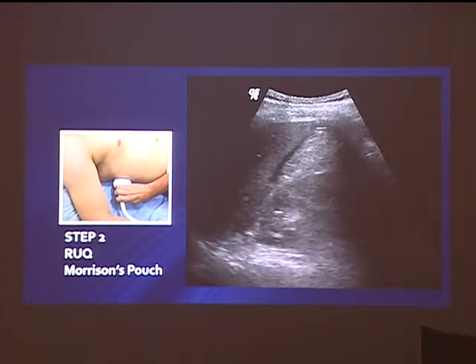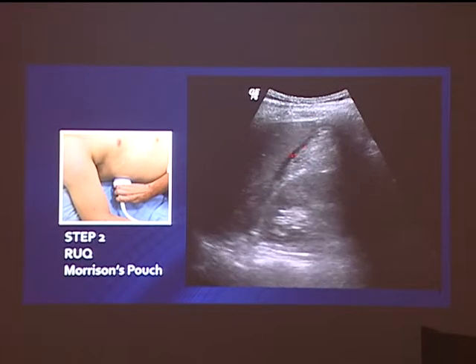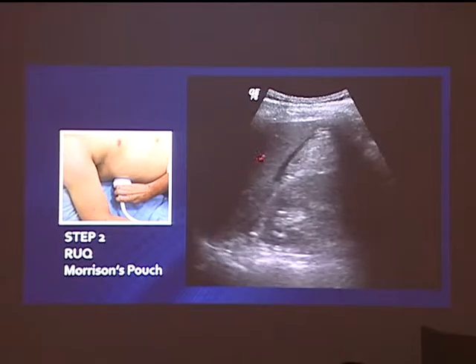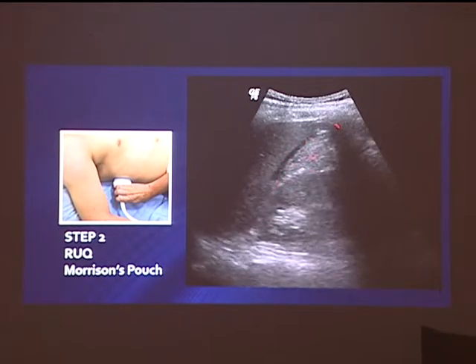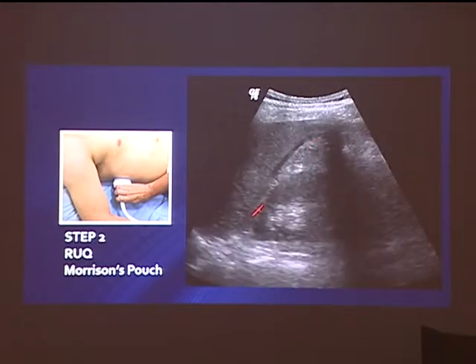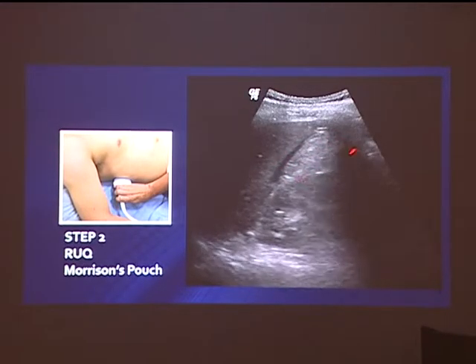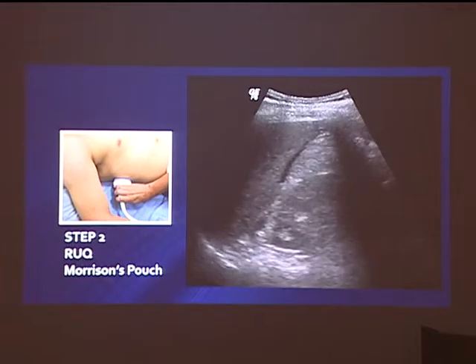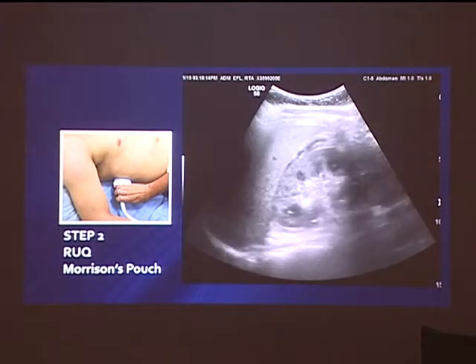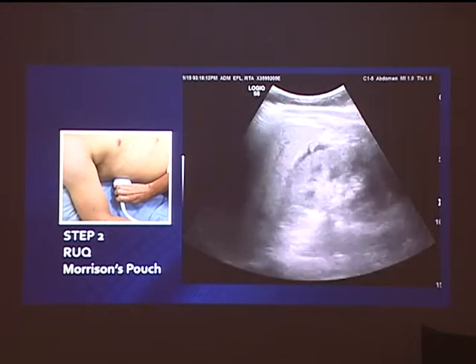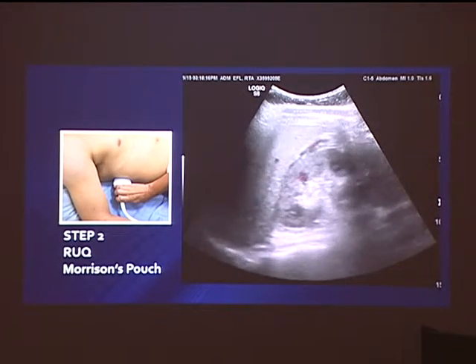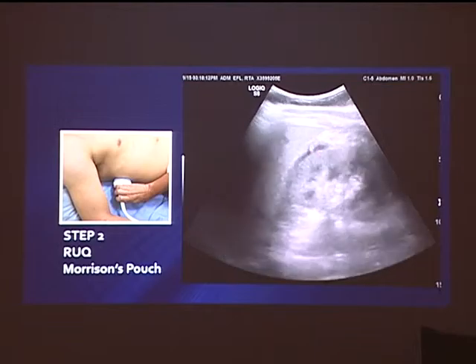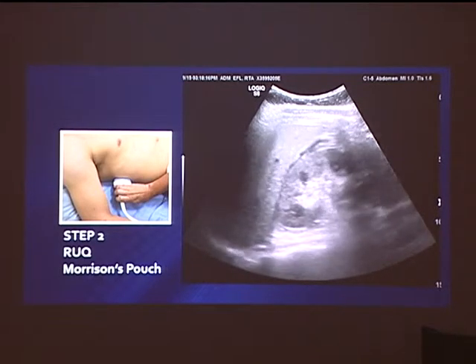Morrison's pouch — any problem? Yes, there's a sliver of a dark band here. You have to examine carefully whether it's a vascular structure inside the liver or fluid in the space. For this patient it is hemoperitoneum — blood in Morrison's pouch. These are probably fat or tissue from inside the abdomen, but this is really Morrison's pouch being separated by fluid. Another patient: this is also abnormal — a positive FAST, Morrison's pouch filled with something. Sometimes there are false positives: vessel structures or capsular structures can mimic this, so examine more thoroughly.